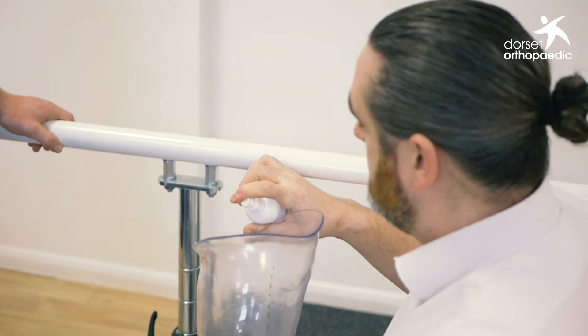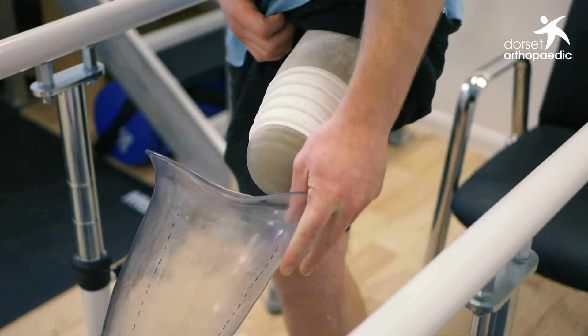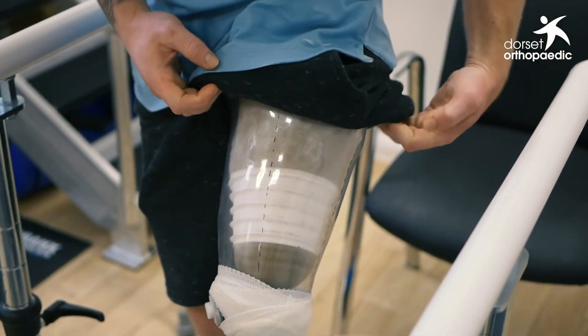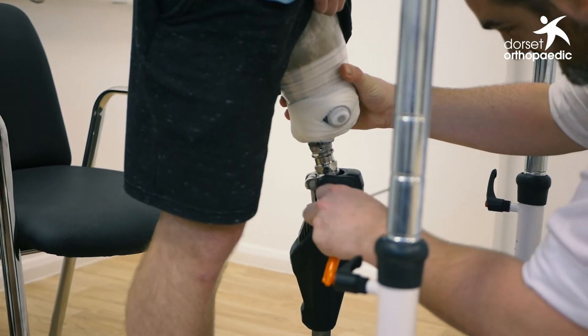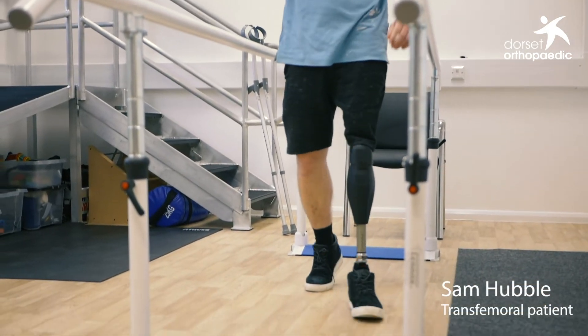The fitting process is very similar to what it would be with any cast that's been taken; however, we can be more confident straight away that the volume would be correct, having had this very consistent way of casting the individual. Typically we can put patients on the test socket following an AquaSymphony cast and they're immediately fitting so snugly and securely, reporting good comfort.